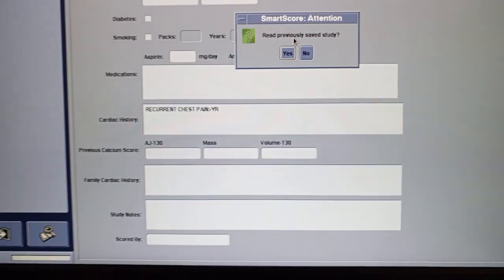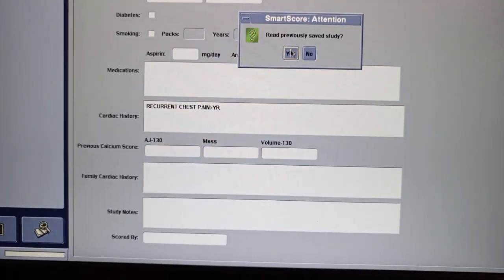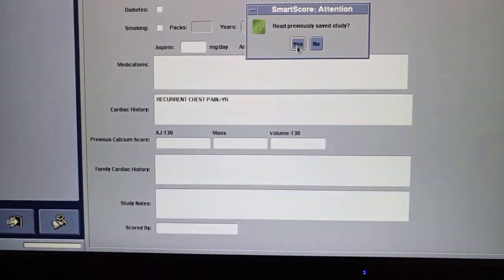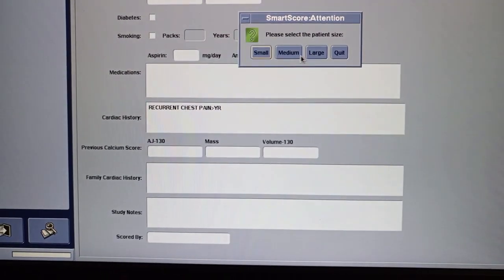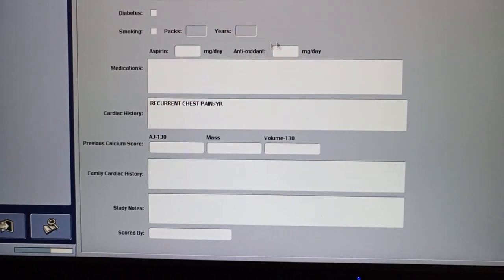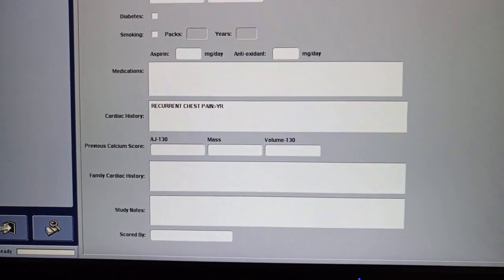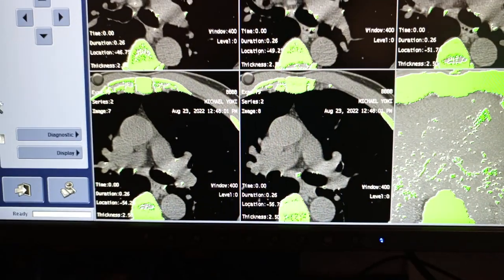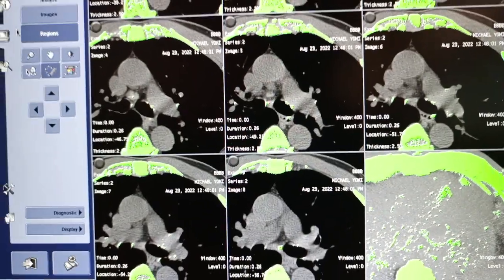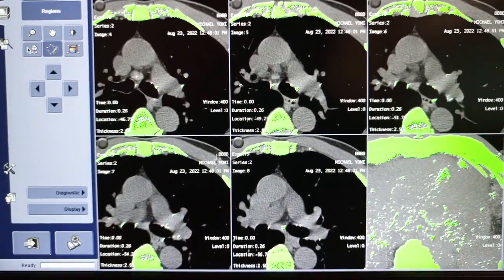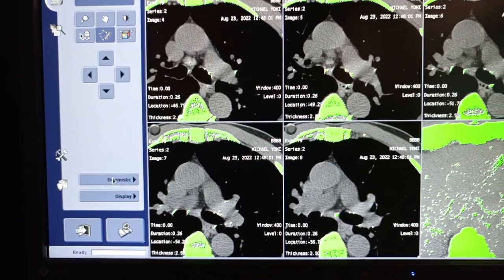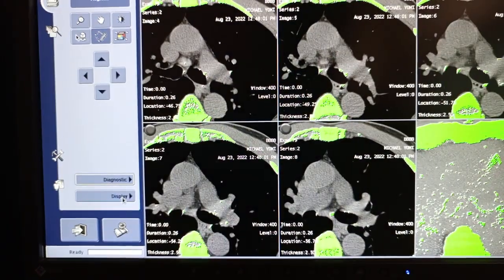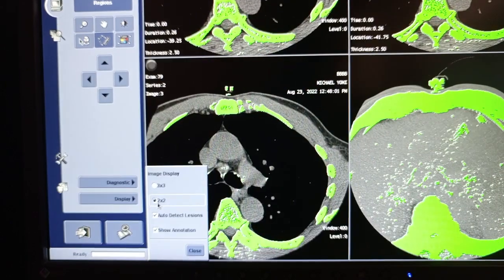The calcium scoring software is loading. It's asking whether to use the previous session or start fresh — let's say no and start afresh. The patient is medium size, so use that info. You can skip some fields. When you come to the diagnostic display, go ahead and set it to two by two.